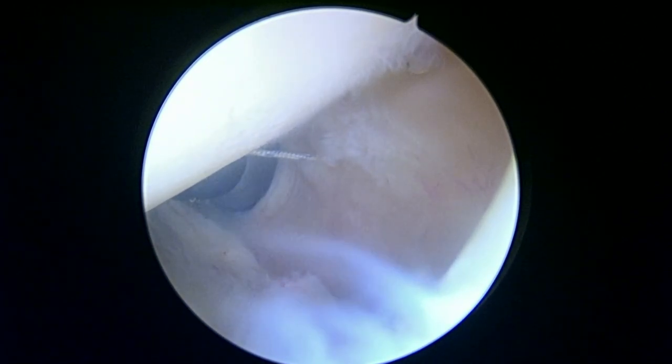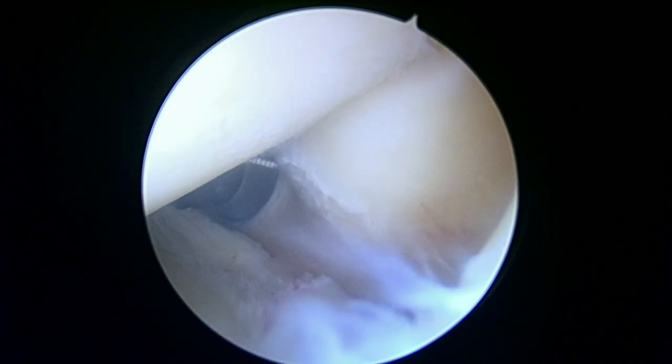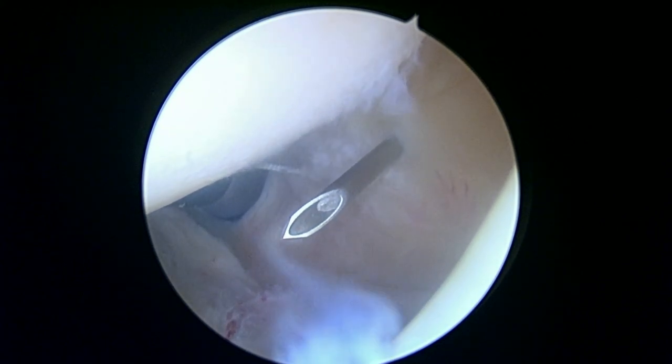We're going to use that spinal needle one more time — do the exact same thing, except this time we're going to be a little bit more interior. You can see where we're trying to get to. Obviously you don't want to tighten things too much, but that looks pretty reasonable as what we sometimes call a rip stop stitch.